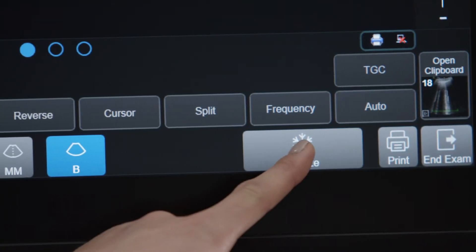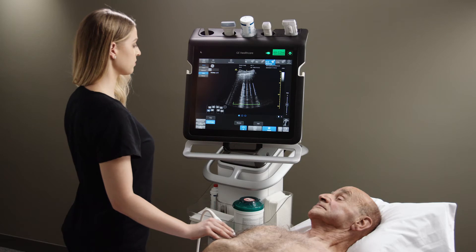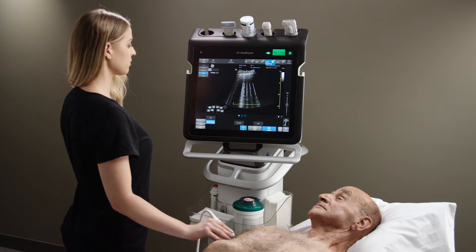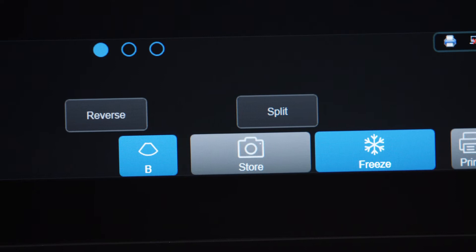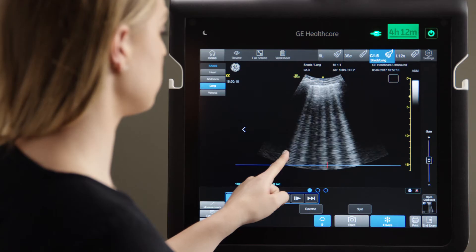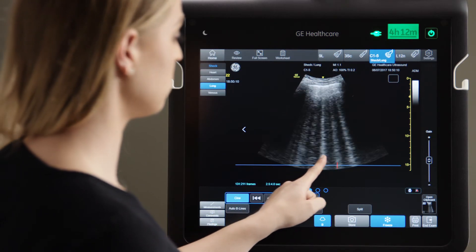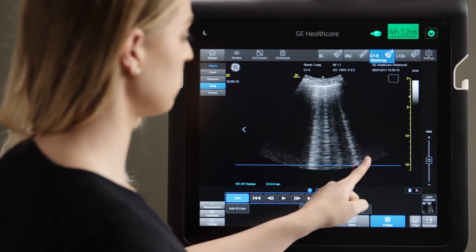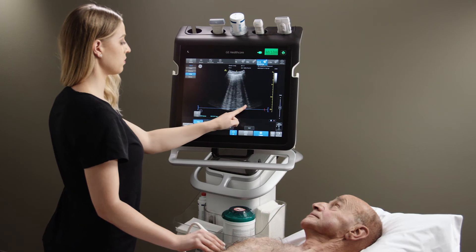Press Freeze and Venue automatically searches and displays the frame with the highest beeline count, and saves it to the lung segment you are scanning. This saves you time from scrolling through all the frames to find the one showing the highest beeline count.